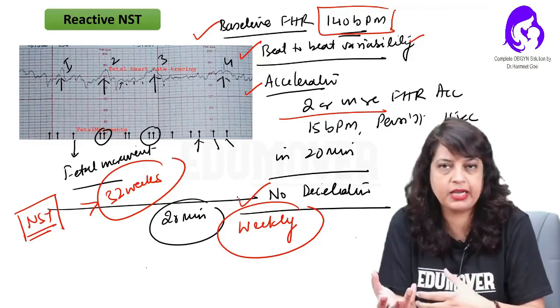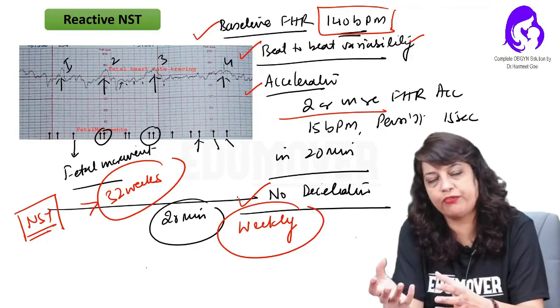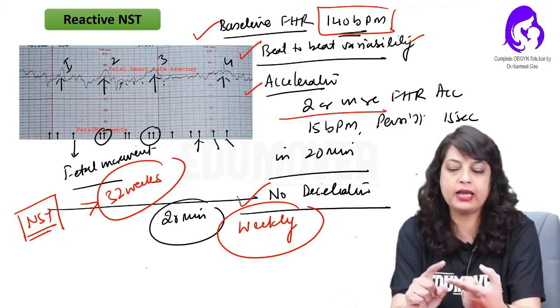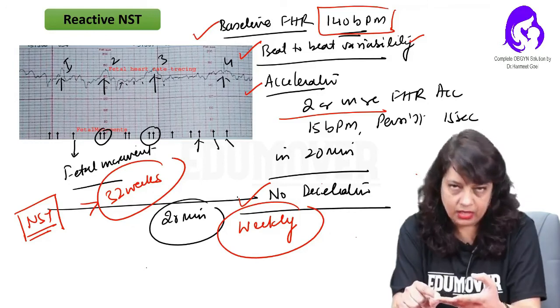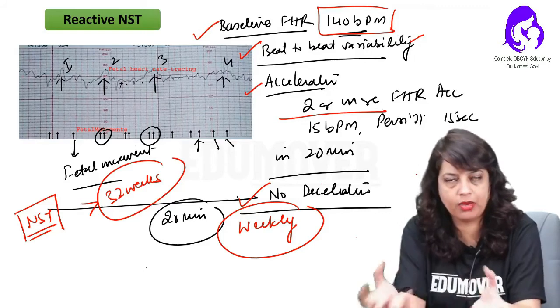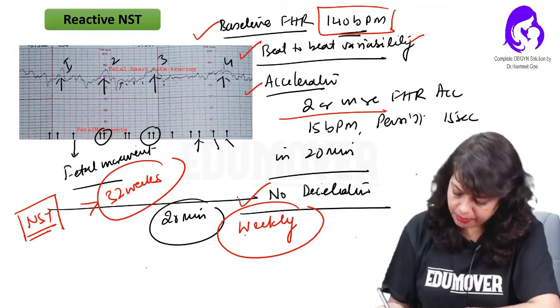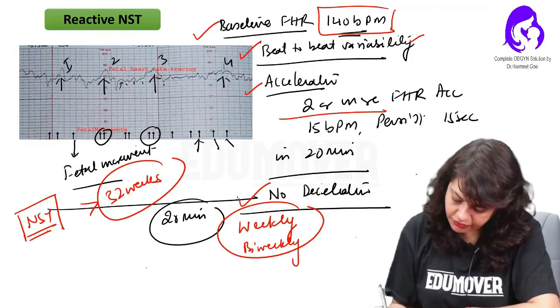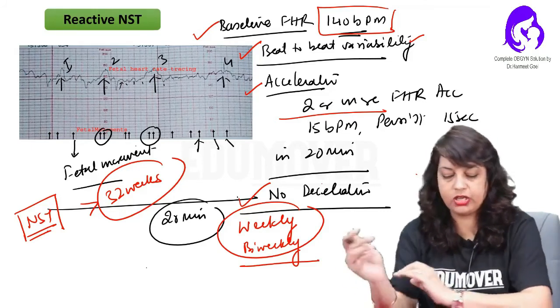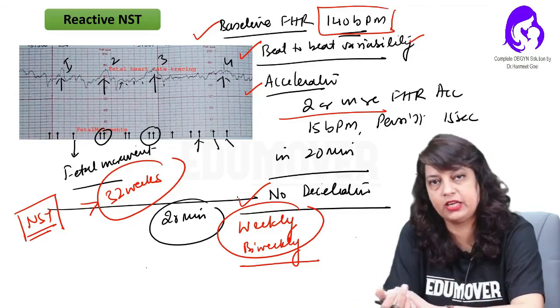And if it is a high risk pregnancy, then we assess and do the pelvic assessment and then admit her for termination of pregnancy after she has completed 37 weeks, by induction of labor or by doing a cesarean section, depending upon whether it is a contracted pelvis, borderline pelvis, or a normal pelvis, and what is the risk of pregnancy. Okay, so it is recorded at bi-weekly intervals if it is severe preeclampsia or a diabetic patient or IUGR. So depending upon whether it is a low risk pregnancy or a high risk pregnancy, weekly or bi-weekly NST recordings are done.